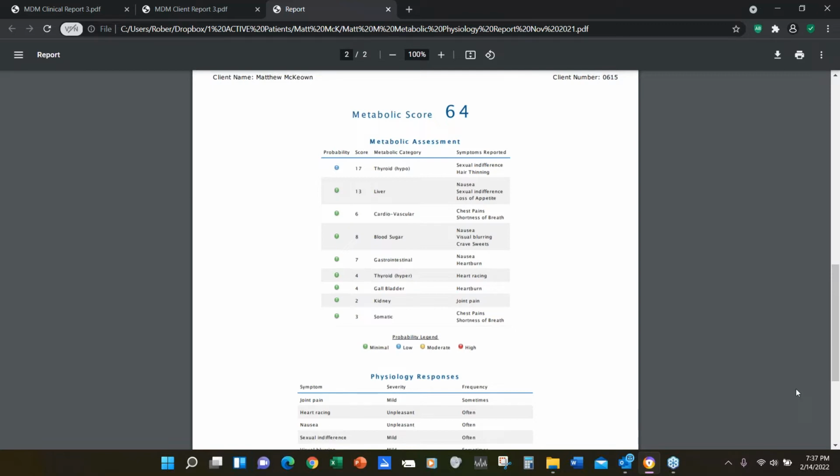The average total score was 78. Now for kids, it's less. I did one for adults and one for kids. I think I did kids up to puberty, just past middle childhood and into puberty. And then from puberty on, I just lumped them in with adults, more or less, as I recall. But the norm I'm talking about is an adult norm. I have discussed the child norm, but I think it went past everybody without them noticing, because it was a pretty condensed discussion that day. But we have those norms for the kids too, and they're much lower than the adults by a long shot.